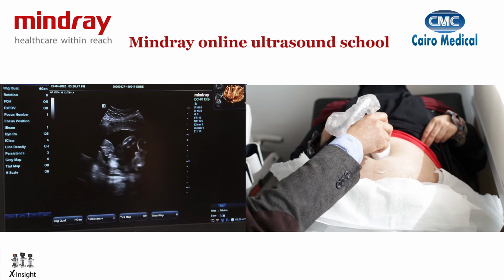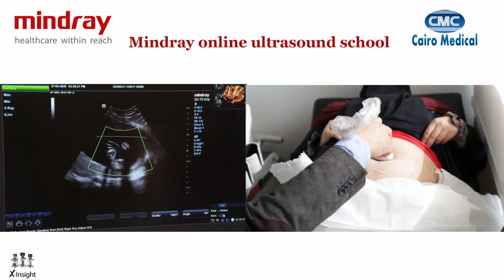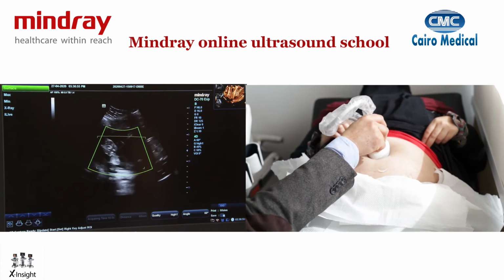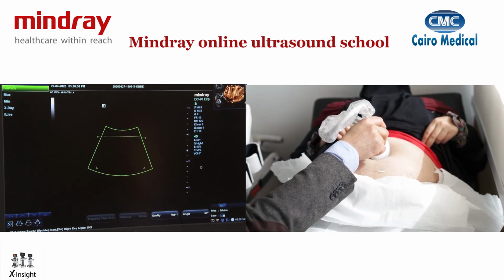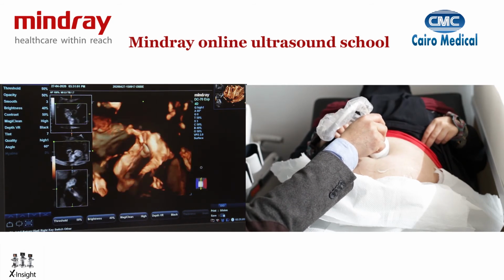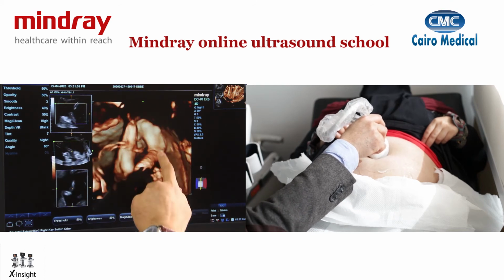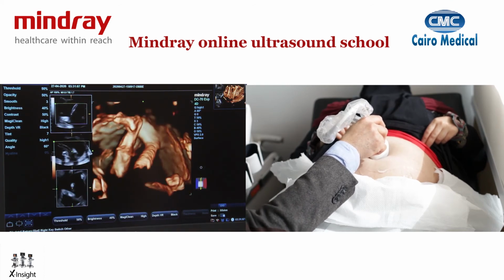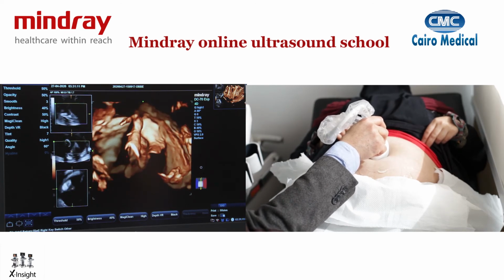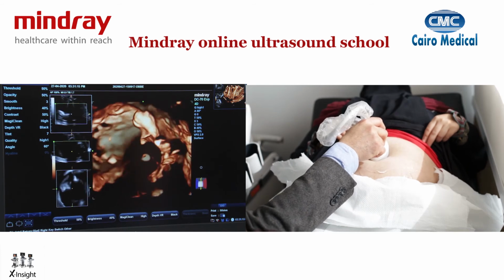If I want to see the limbs, I can put my 4D parallel to my target, because as we mentioned here, we're doing just the surface rendering. Then I can update my image and see the limbs. Over here you can see the ankles, both legs crossed, because I'm parallel to them. If I get a bit closer with my camera, I will see him more closely, but let's do it again. Maybe he has moved.